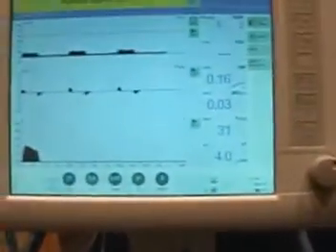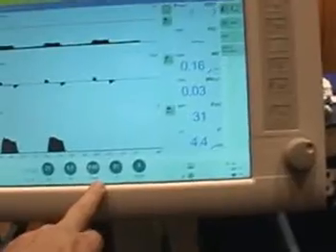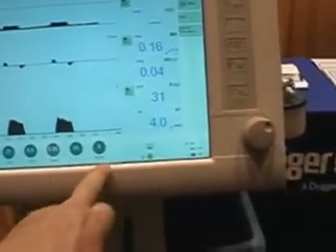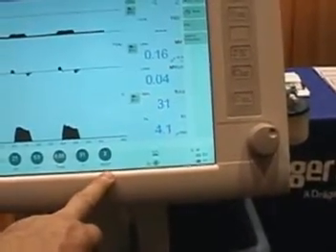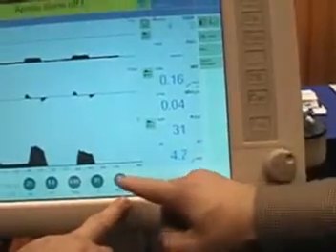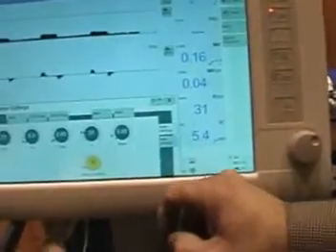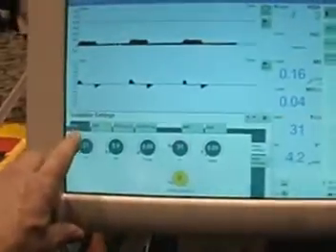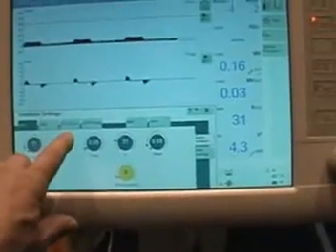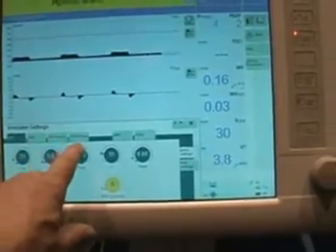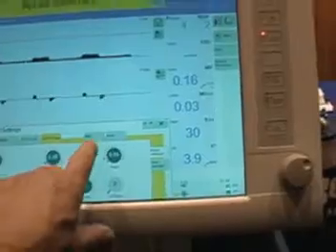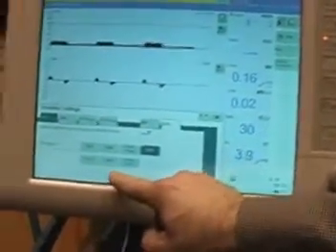The basic controls are down here — FiO2, tidal volume, frequency, and PEEP — and you hit the X to exit. To get to your modes, touch the mode area. The available modes are CMV, PSIV, PCV with assist, CPAP support, MMV, and additionally APRV and PCV plus.